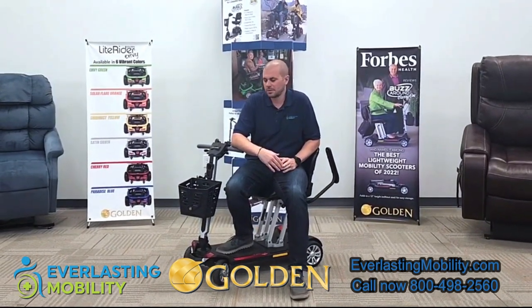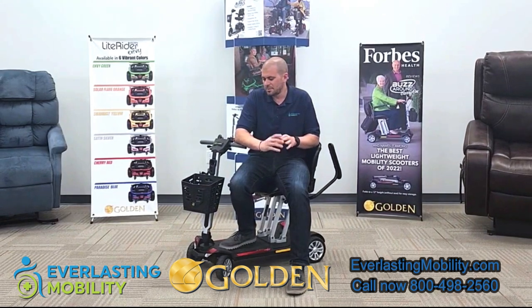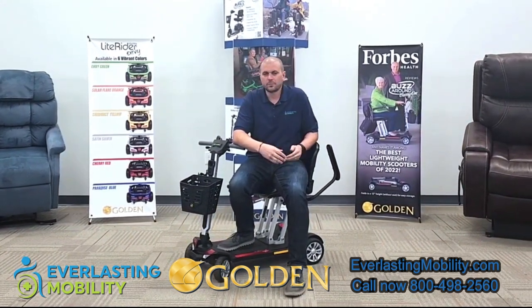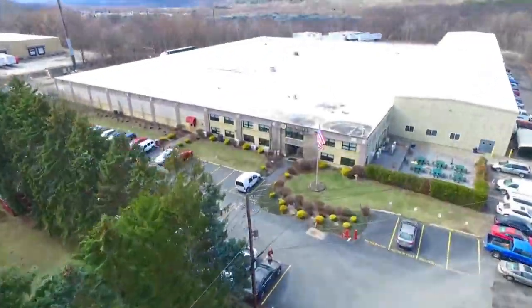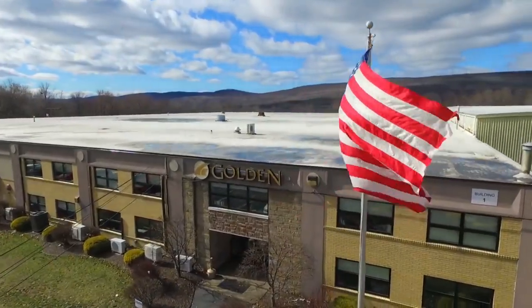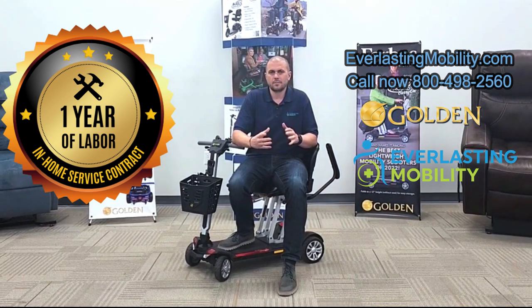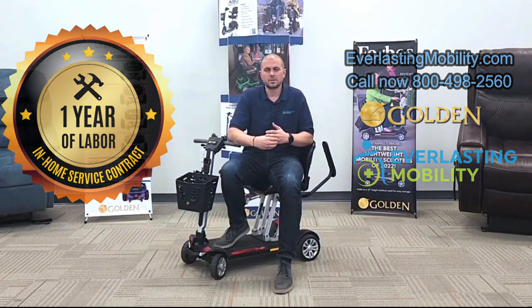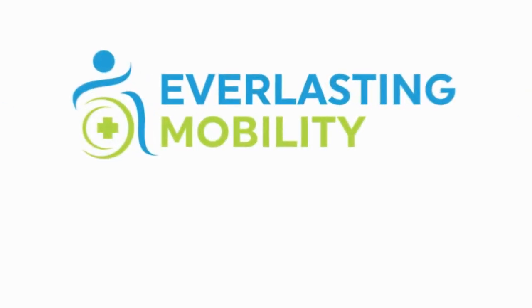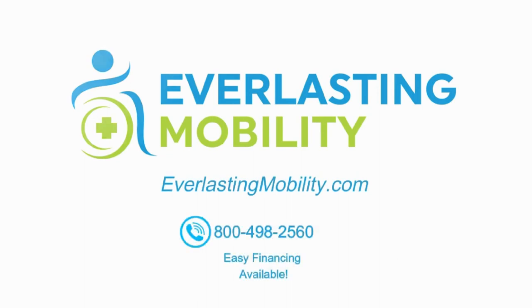In conclusion, if you're looking for an easy-to-fold mobility scooter, the Buzzaround Carry On is a great option. There is an airline approved battery available, it's lightweight, and it's a really awesome scooter. Golden Technologies is one of the best brands in the mobility industry and offers one of the best warranties, which includes one year of in-home service where a technician will be dispatched to your home to diagnose and resolve issues. For questions, call 1-800-498-2560 or visit EverlastingMobility.com.